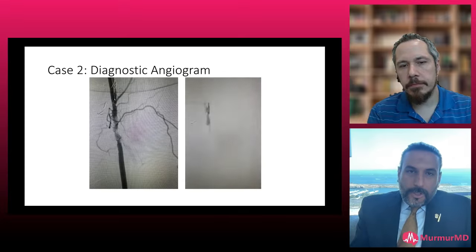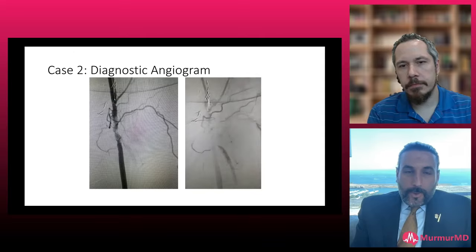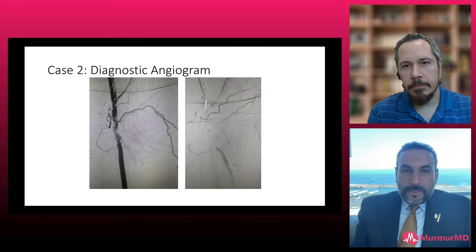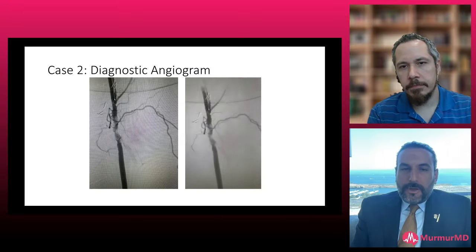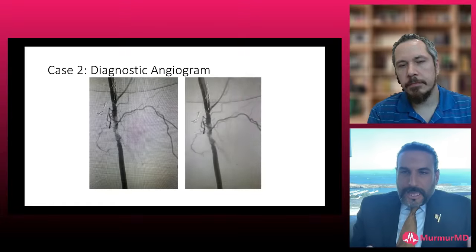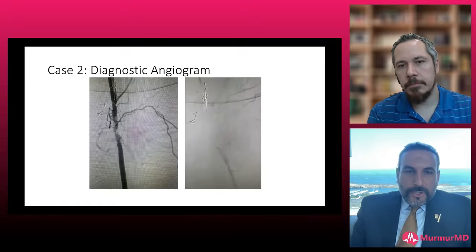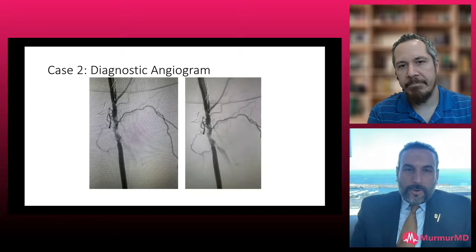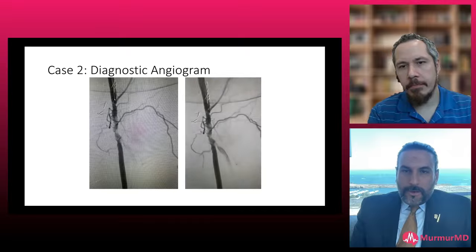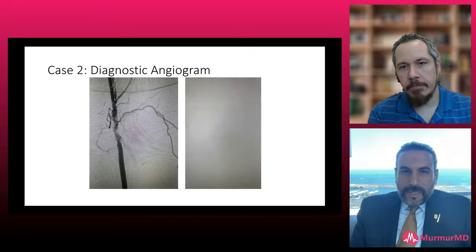I can tell you though, looking at this again, outside of her really not wanting to have surgery, to me, with the bifurcation disease and involvement of the proximal profunda, we would generally at least consider doing this open. If she absolutely was against that, actually, from the cardiology literature, this would probably involve some bifurcation buddy wire technique into the profunda and SFA, protecting these.